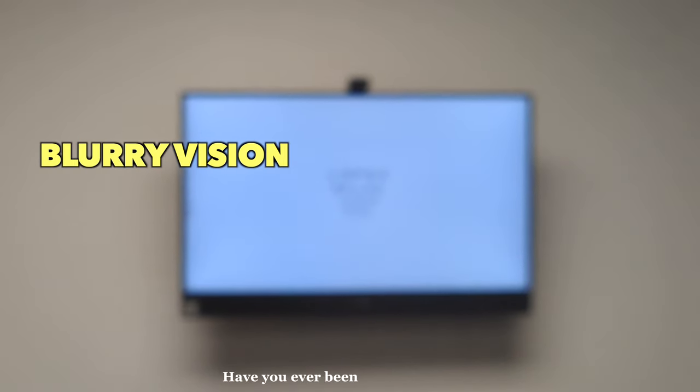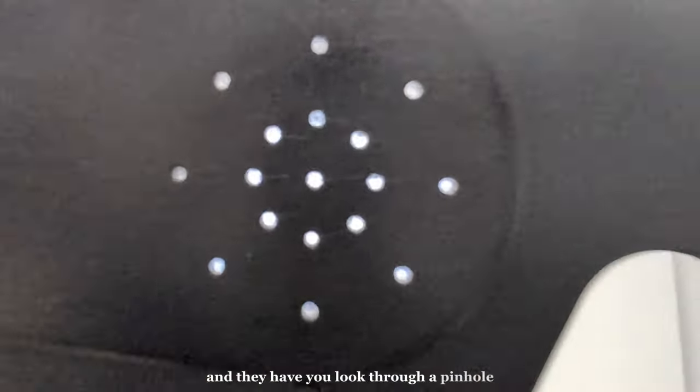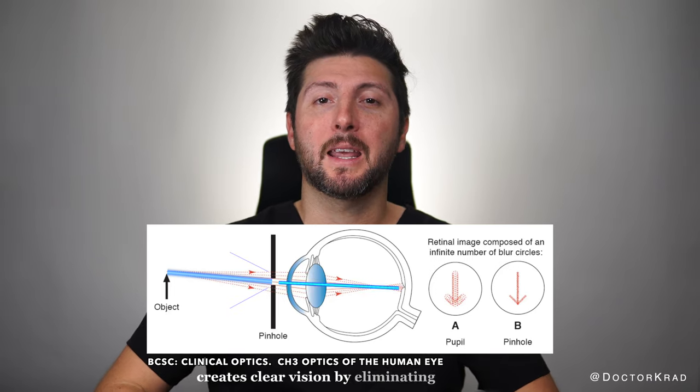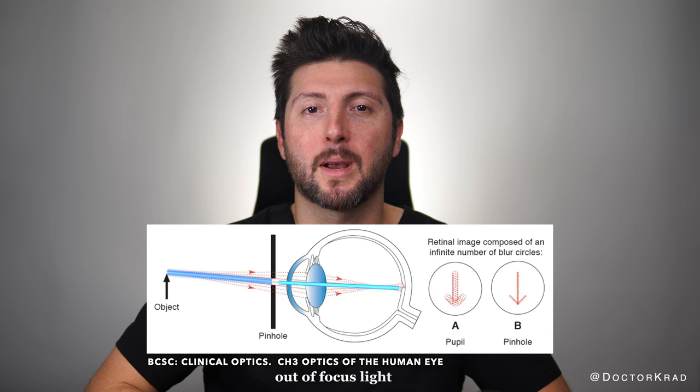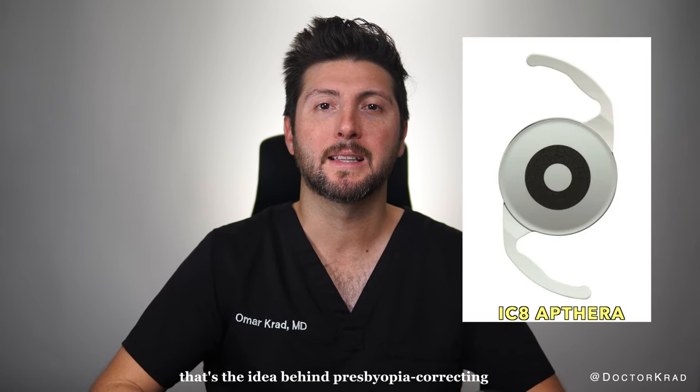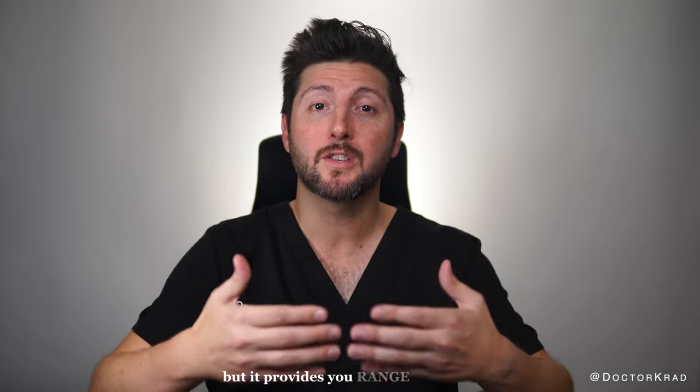Have you ever been to the eye doctor and they have you look through a pinhole and it makes everything clear? It's like magic. The pinhole or small aperture opening creates clearer vision by eliminating scattered out-of-focus light rays. That's the idea behind presbyopia correcting lenses like the ICA Apthera or AccuFocus. Not only does it provide clear vision but it provides a range of vision.